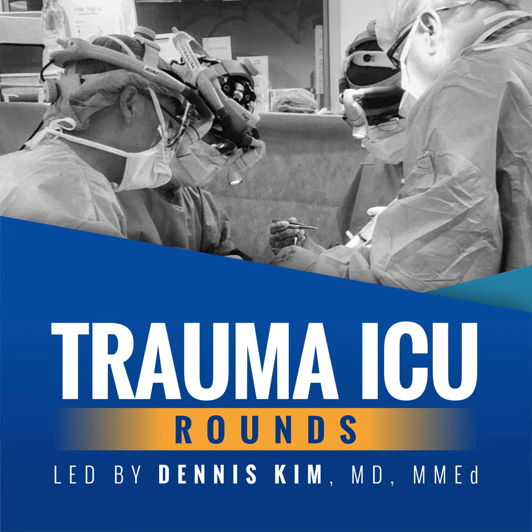With that said, the most recent 2017 clinical practice guidelines published by the American College of Chest Physicians in conjunction with the American Thoracic Society when it came to liberation from mechanical ventilation in critically ill adults, conditionally recommend that for acutely hospitalized patients ventilated for more than 24 hours, the initial SBT should be conducted with inspiratory pressure augmentation, 5 to 8 centimeters of water, rather than without, i.e. T-piece or CPAP.